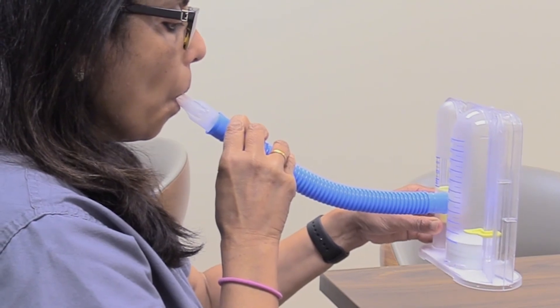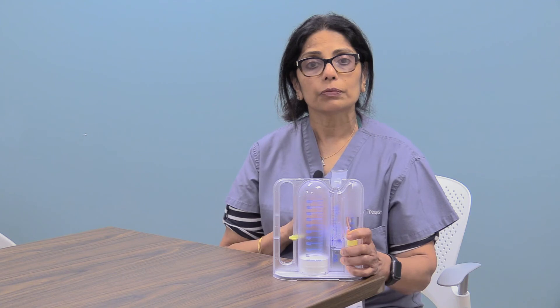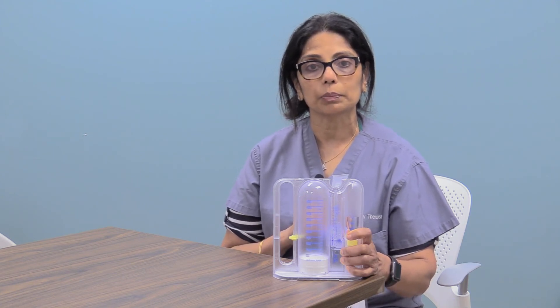Place the marker at the highest number you reached and try to improve on how high you go each time. We recommend you do this for a total of 10 breaths every hour while awake. Focus on doing slow, deep breaths and doing it properly and you will see your numbers improve. When using the incentive spirometer, remember to breathe in through the mouthpiece and not breathe out into the mouthpiece.